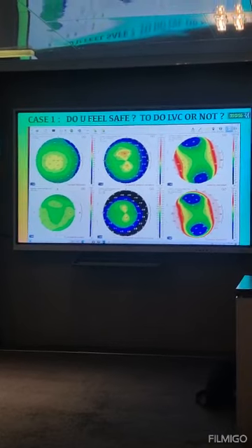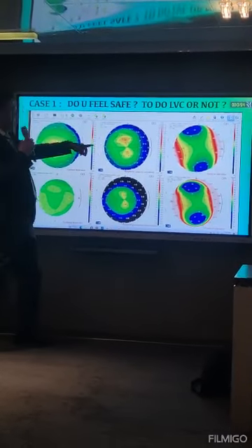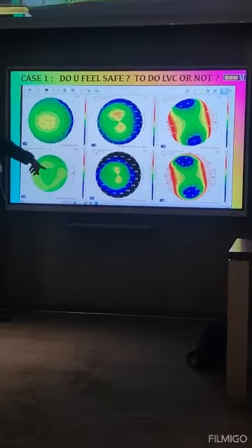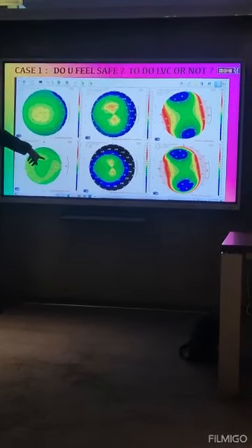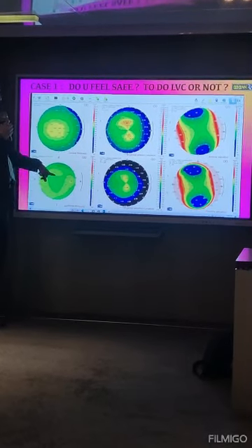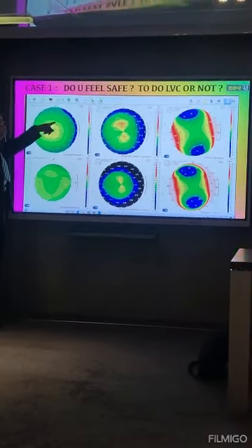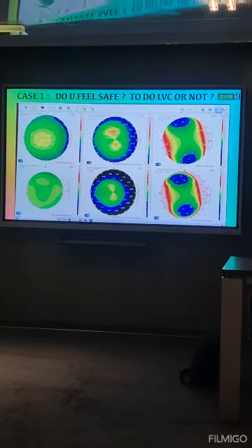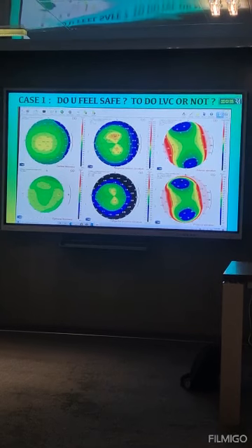Okay, but look at the superior point here. The superior steepening. But you mentioned there is a superior ptosis. This could be an effect of the ptosis. So I mean, there is thickening here at the steep point of the superior cornea. So it's not thinning. Yes, sir. Let me comment on this, please.